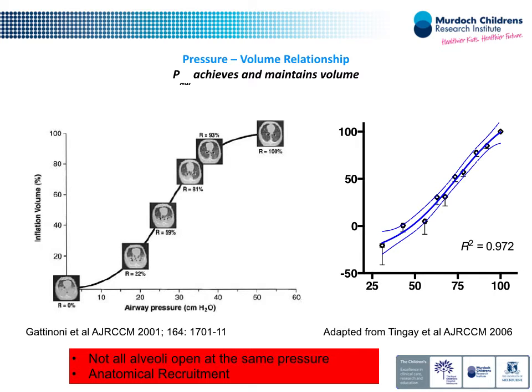You talk to a PICU consultant or an adult intensivist, when they see ARDS, they see real lung disease. We see weak ARDS, essentially, compared to what they see. So this is a really nasty atelectatic lung here. But my question is, when you try to achieve the best inflation, you may still have scenarios that at that pressure there are already some overdistended areas.